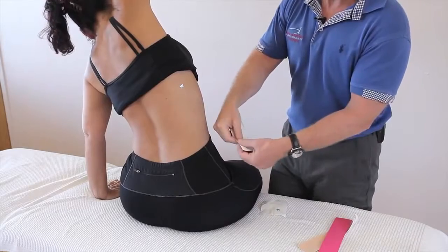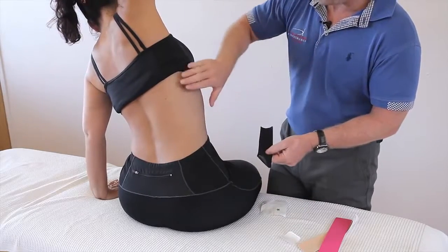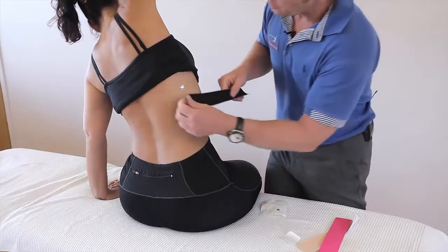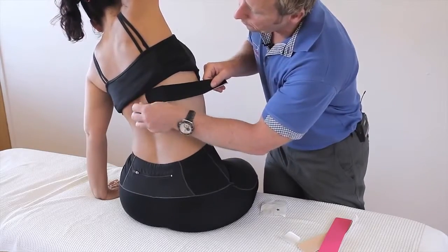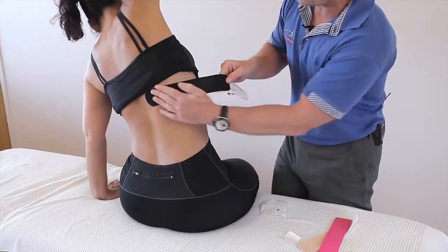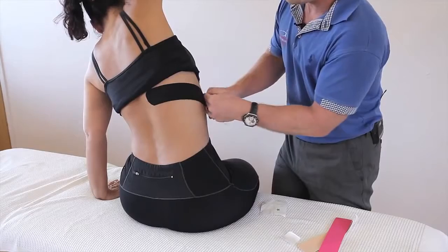For the first one, turn the tape over. The pain might be localized to one rib or might be over three or four ribs. Bring the tape posterior to the pain, like so. We're going to use little to no stretch — about 10% — just crossing that area of pain.